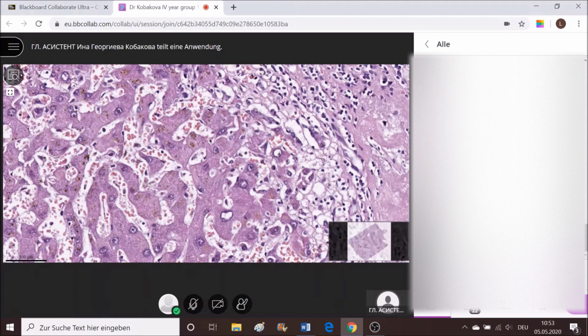I'm not quite sure whether I understand your question. Can we still distinguish the structure, the triad, if everything has a very thick wall? Well, I don't distinguish the structures of the triad here. Here I don't see any, actually. What I observe here is exactly this field, which can be named more easily, but I don't see a triad here.